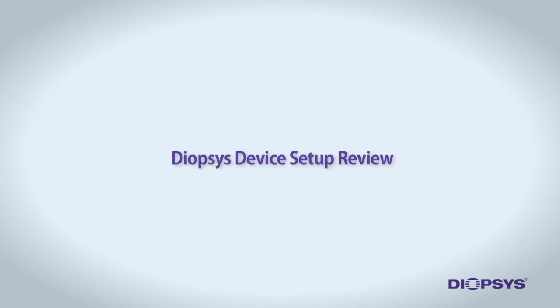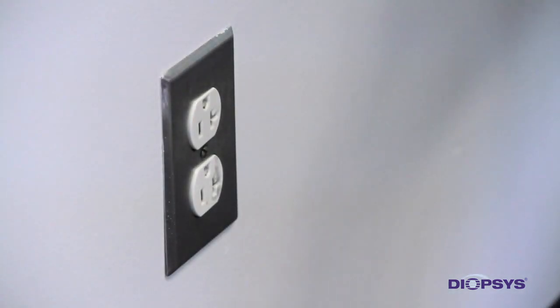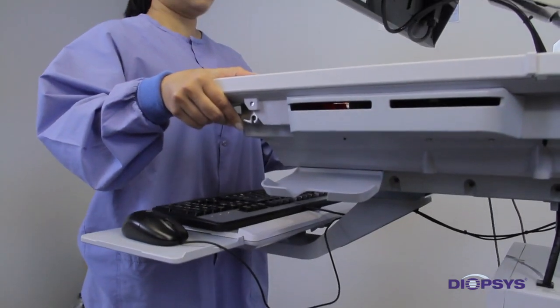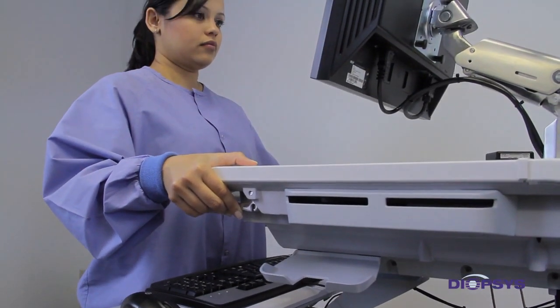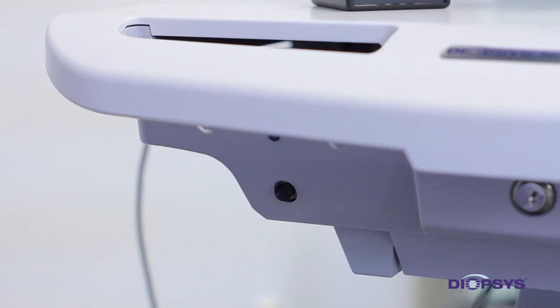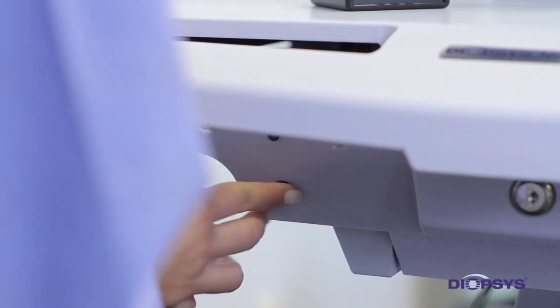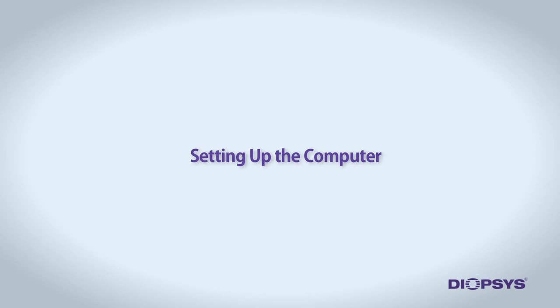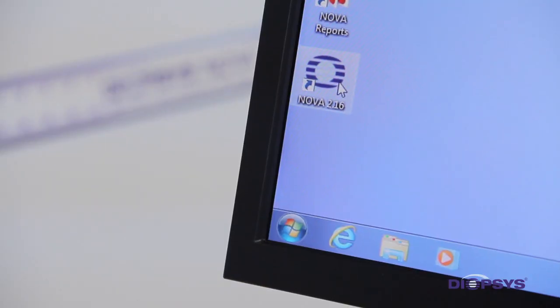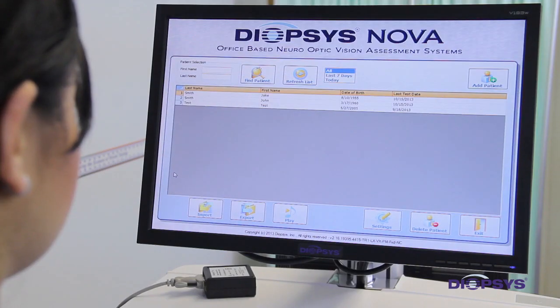Before testing patients using the Diopsis NOVA Vision Testing System, we will review some of the features of the device. First, you must plug the device into a dedicated, properly grounded power outlet. Next, you may adjust the height of the operator's tray to your height for comfortable viewing of the screen and ease of use of the keyboard and mouse. To turn the device on, press the black power button located just beneath the left side of the operator's tray. Once the device has successfully started and the operator's monitor is on, double-click on the NOVA icon on the desktop. This will open the NOVA Vision Testing Program.